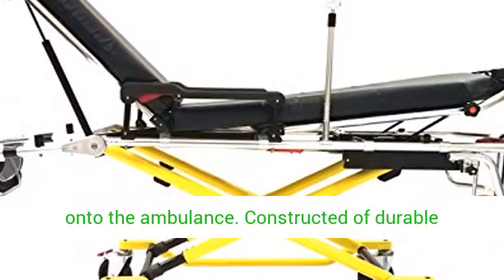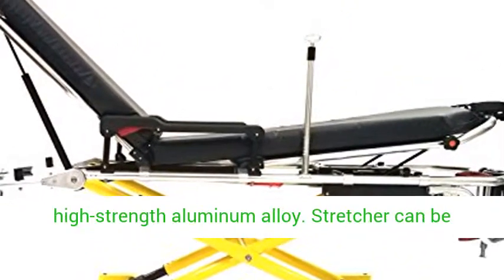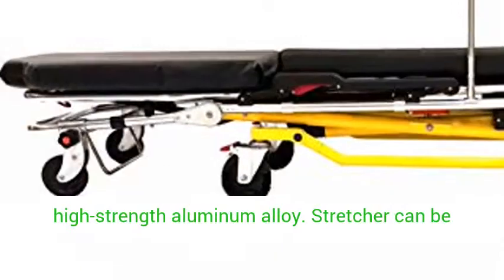Constructed of durable high-strength aluminum alloy. Stretcher can be locked by the safety locking device while vehicle is in motion.